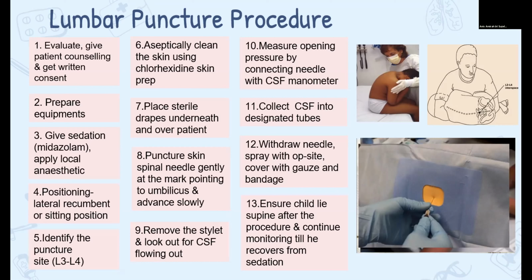So when we advance the needle slowly, you will feel a sudden give, like a pop, because there's a change of resistance when you penetrate the dura and enter the subarachnoid space. Then remove the stylet and look out for the CSF flowing out.